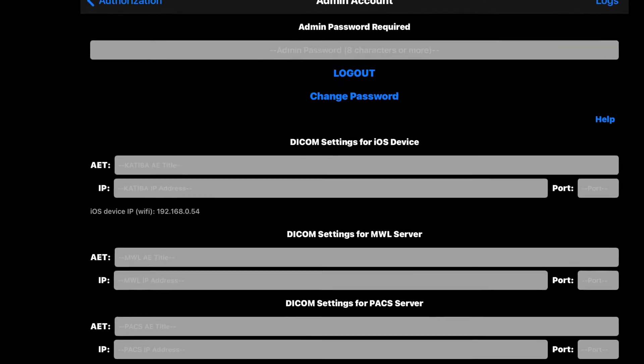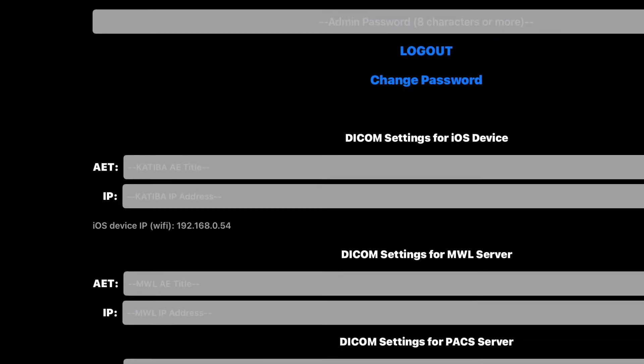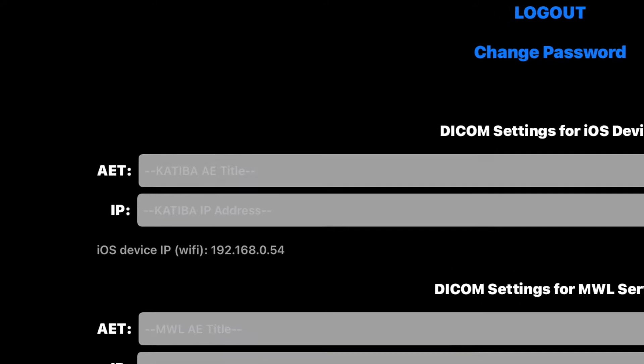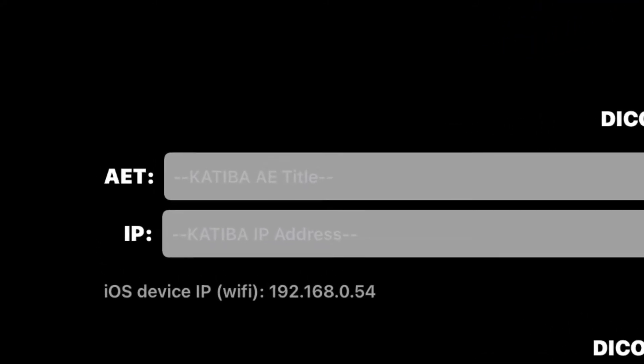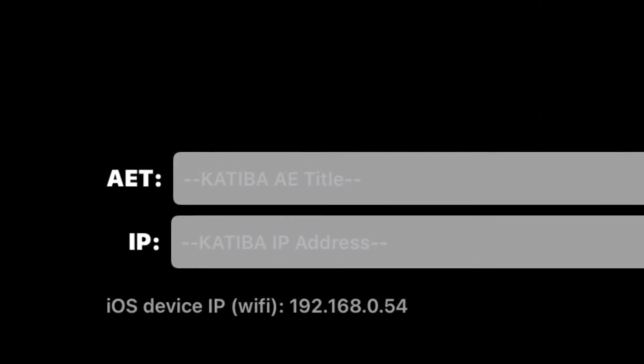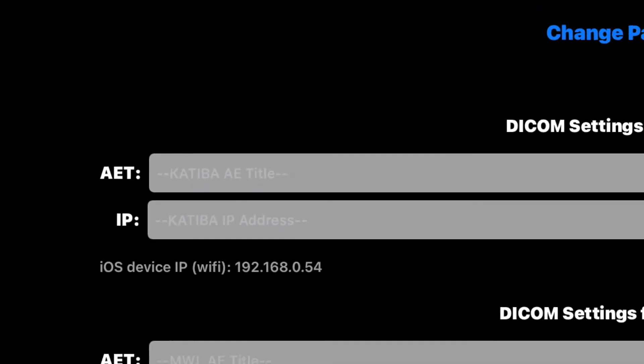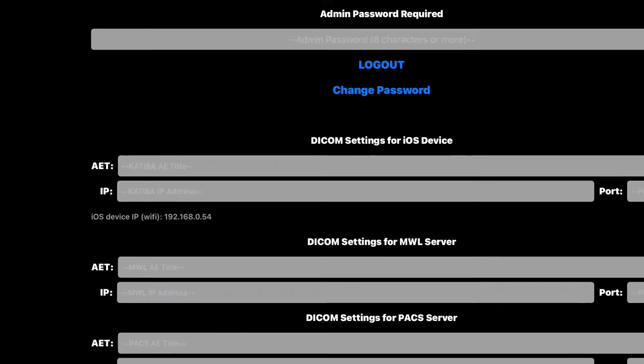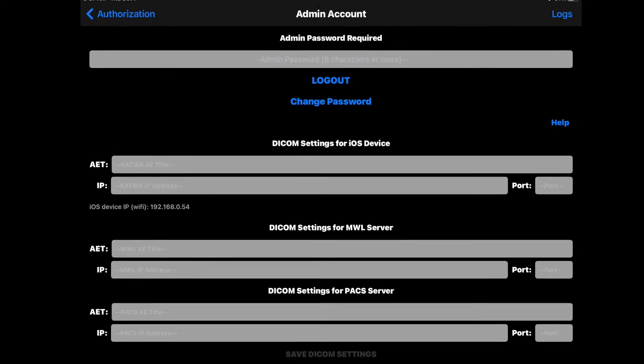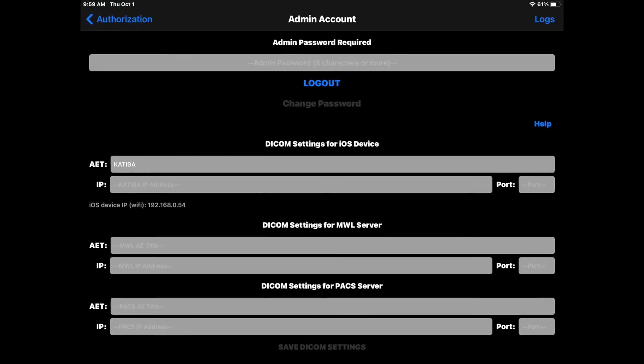Enter an application entity title or AE title for your iOS device. This very same title must also be registered on your DICOM server. We recommend using Katiba as a unique title for the app.